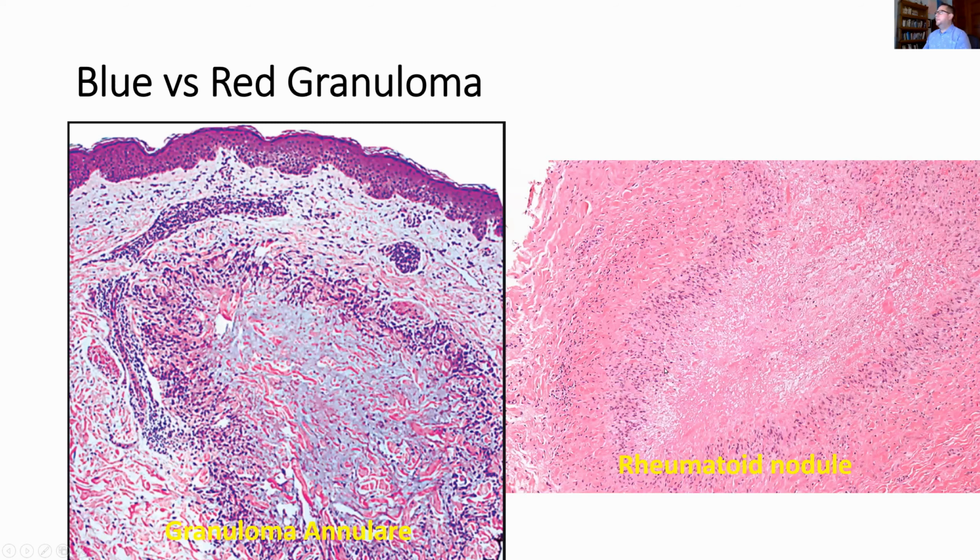So this is actually an issue you run into when you do get biopsies, because granuloma annulare may be near joints, and rheumatoid nodule almost always near joints. But here we have granuloma annulare. Wegener's can have this pattern, and then we see rheumatoid nodule over here, Churg-Strauss, and Whedon lists necrobiosis lipoidica as having the red center when it has palisaded inflammation.